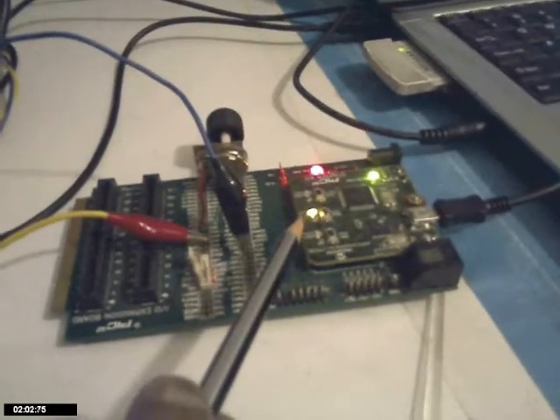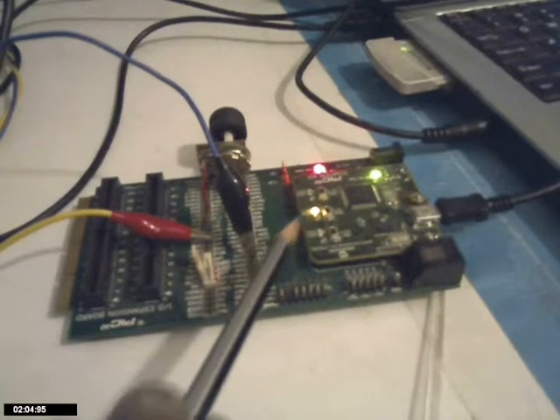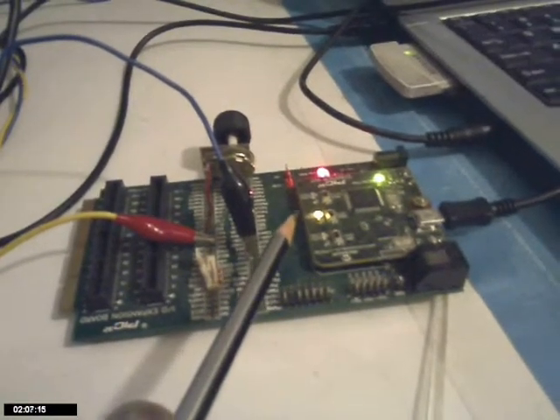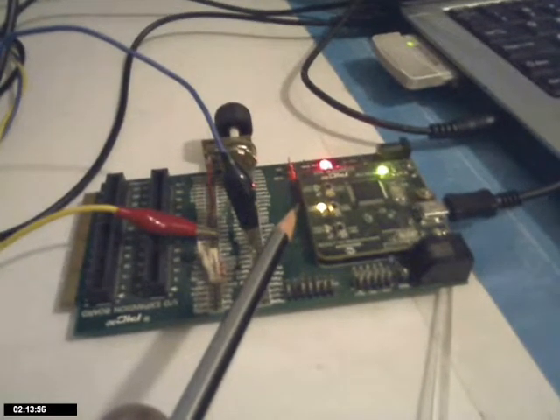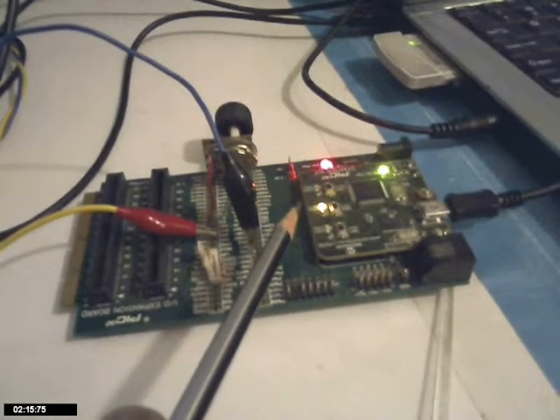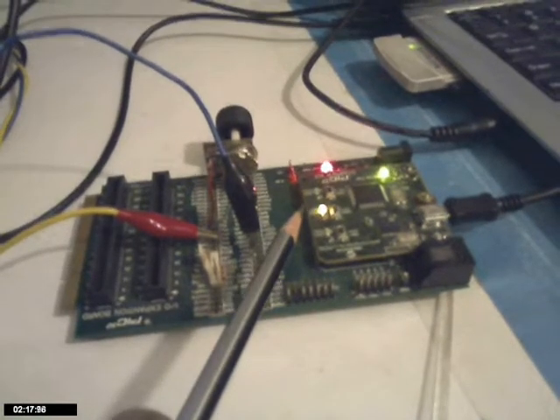You can see that's the middle one, LED, which is glowing. That's orange in color. It shows that the breath rate is normal. It's about 14-15 breaths a minute to about 26-28 breaths a minute.